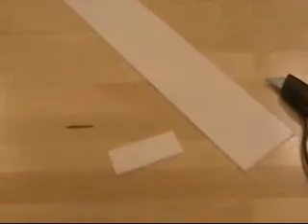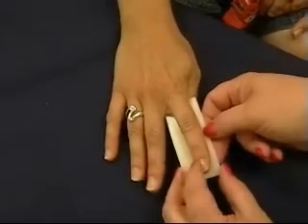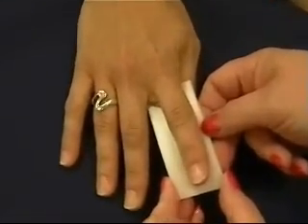Lastly, before I begin to make the splint, I want to make sure that that piece of material is going to be large enough for my purposes. So I'm going to just line it up with the patient's finger to make sure it will be long enough and wide enough to work.